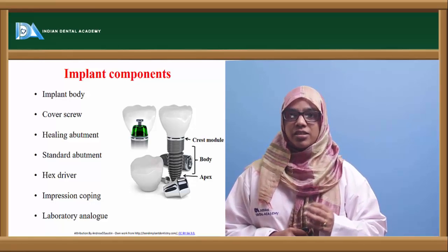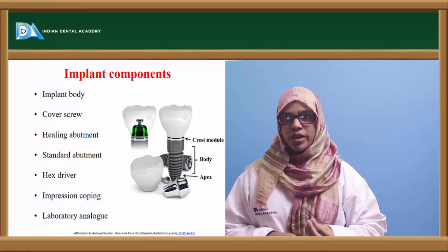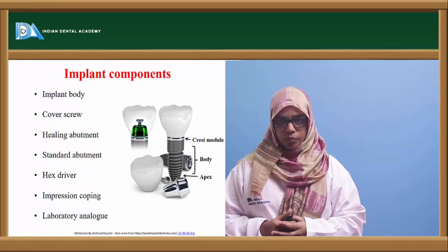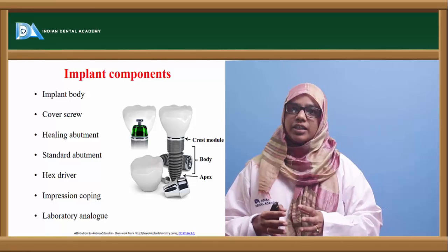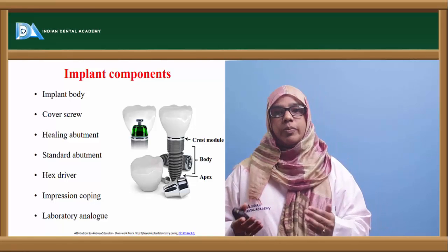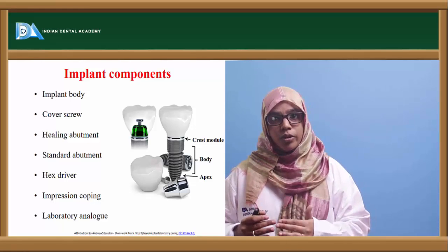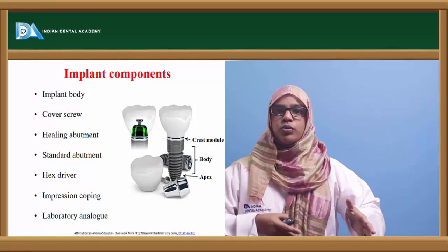Then comes your hex driver. Now, the hex driver is used to remove the screw and abutment or healing abutment from the implant. Impression coping. Now, impression coping is nothing but a simulator of your standard abutment, which is placed in the patient's mouth and impressions are made. Now, this will simulate the position of the implant from the oral cavity onto the cast.